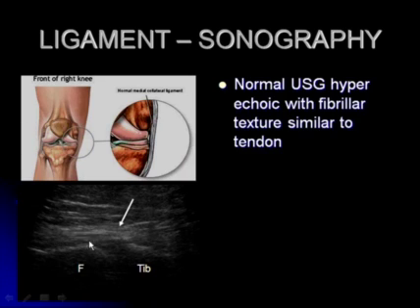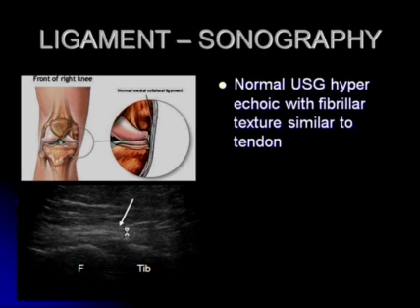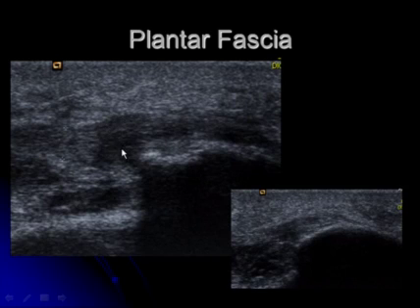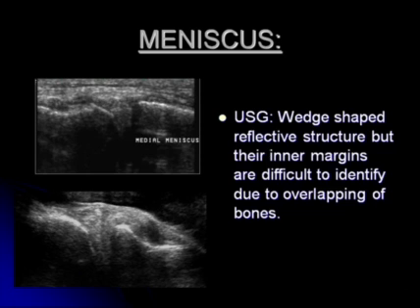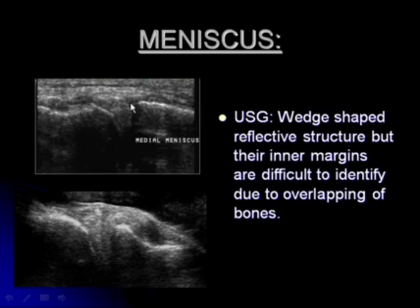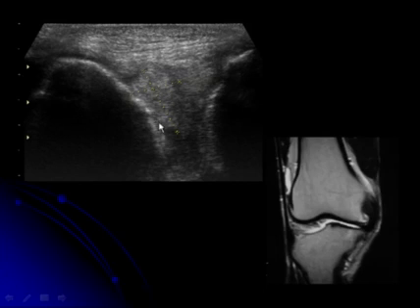Ultrasound can also look at ligaments. A ligament almost looks like a tendon with a normal hyperechoic appearance and fibrillar texture pattern. Here is an example showing the rupture of a collateral ligament at the knee joint with a hematoma. Here is a thick plantar fascia at its insertion — hypoechoic and thickened compared to the normal on the opposite side. This is a case of plantar fasciitis. Although MRI is the choice for diagnosing meniscal tears, in some rare cases, ultrasound can look at the meniscus at the peripheral part of the knee joint, and there is one case which showed a meniscal tear on ultrasound.